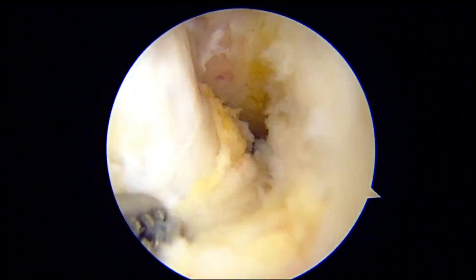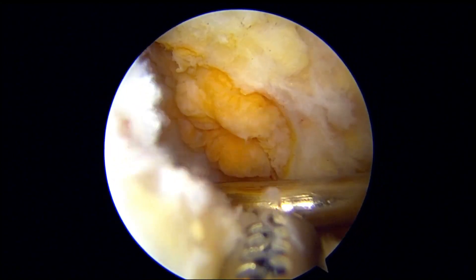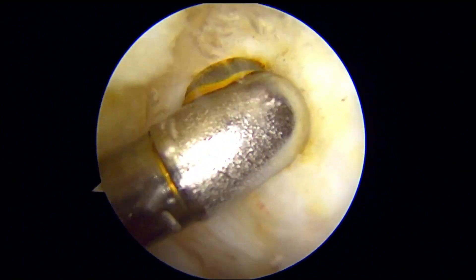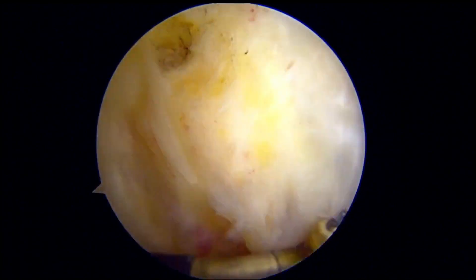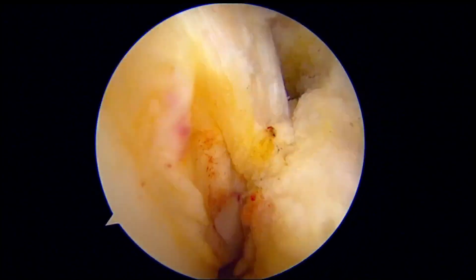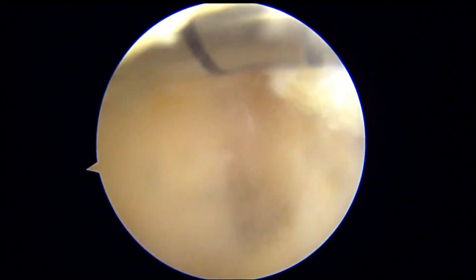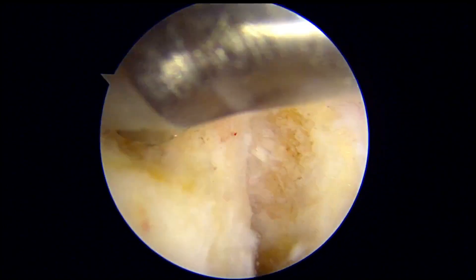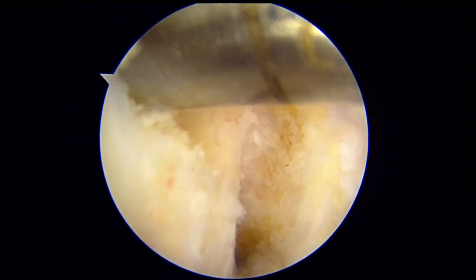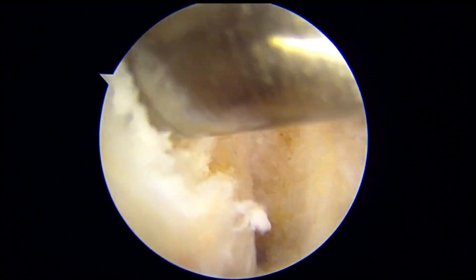The viewing camera is moved to the anterolateral portal. The PCL footprint is identified, and a marking is made at the central point of the remnant and as close to the cartilage as possible to mark the femoral tunnel. The viewing camera was moved to the anteromedial portal. The femoral tunnel was then created by inserting a K-wire, followed by sequential drilling. The desired depth for the femoral tunnel is 15 mm. The passing suture is then passed through.